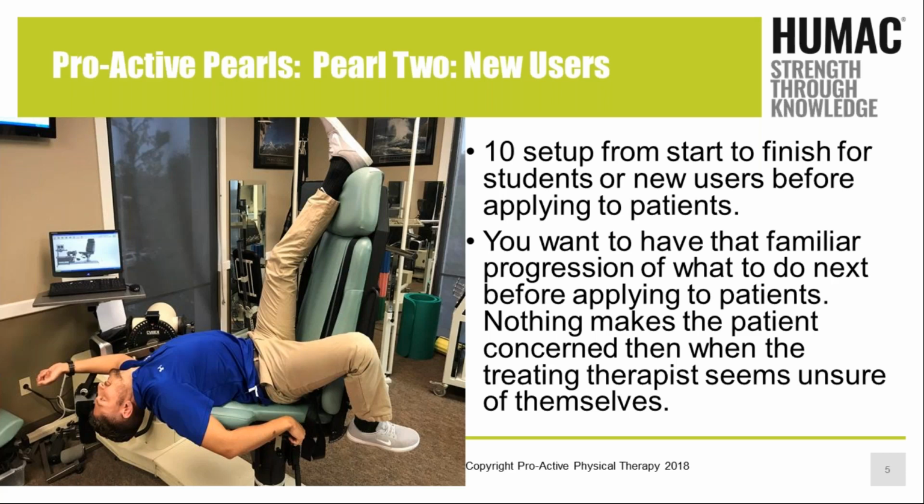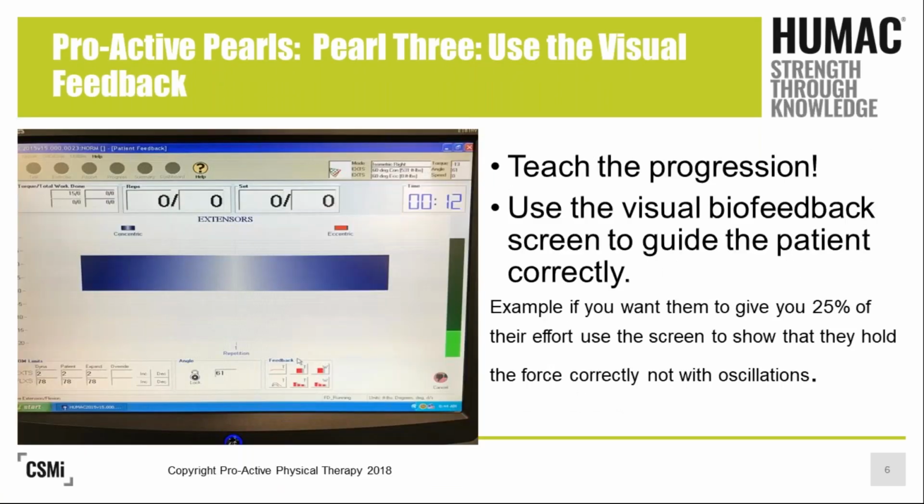What I normally see with a lot of my students is, they start off at 1, 2, they make a mistake early on in the software. They get to 3 to 4, they're going through the software, now they're aligning incorrectly. We get to 6, 7, they've gone through software, they've gone through alignment, now they're starting to attach them to the position, but do they set up the start and end positions correctly? By the time they get to 8 or 9, they're doing everything correctly, and at 10, they feel very confident in what they're able to do.